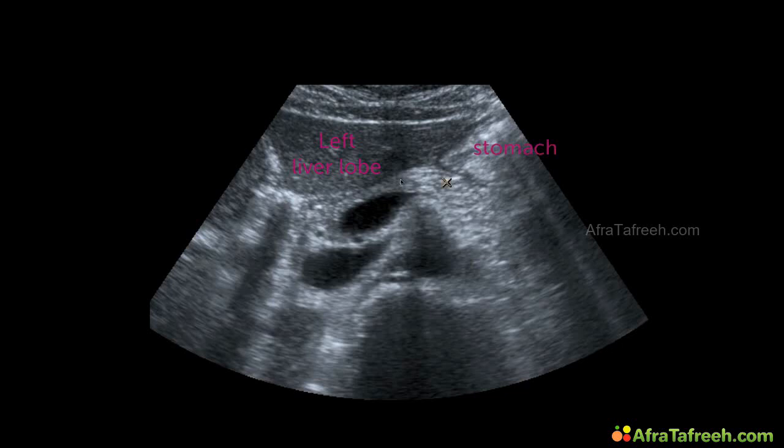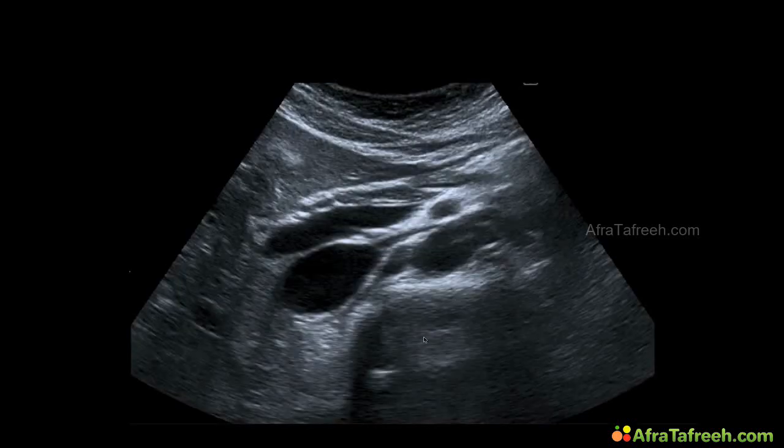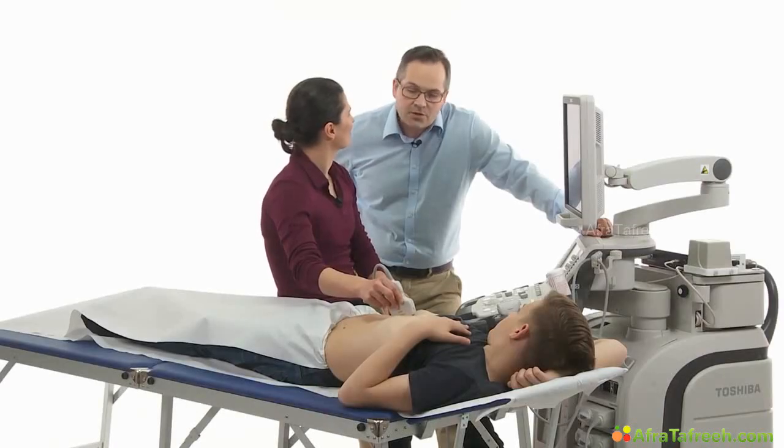Again, we see some parts of the stomach. There's gas inside. And over here, a very lovely picture of the pancreas. Okay, but that's a later chapter. Okay, so we go on. Again, the tip of the left liver lobe over here, and the inferior vena cava over here. Can you show us the very left liver segments again in the second plane?